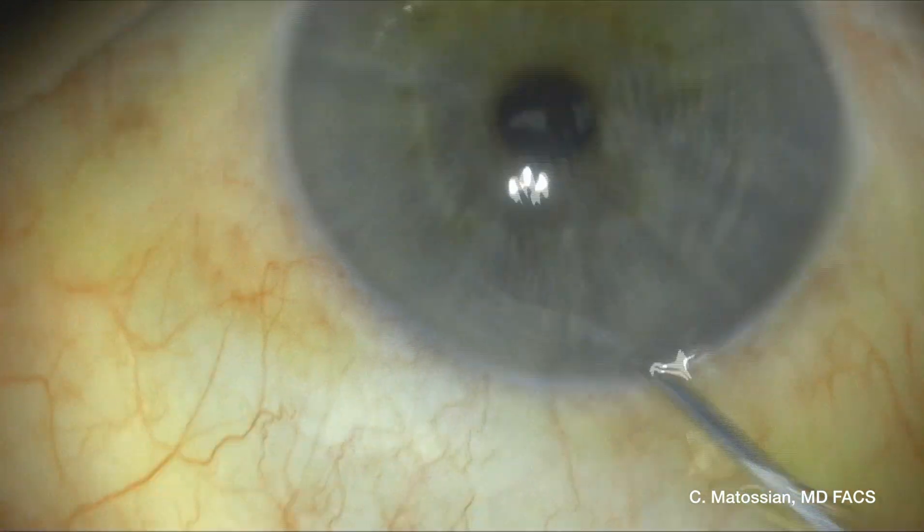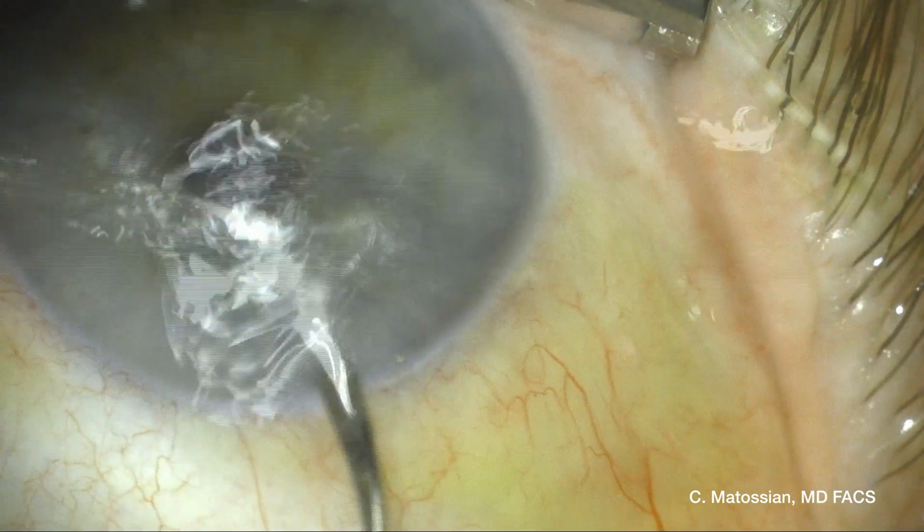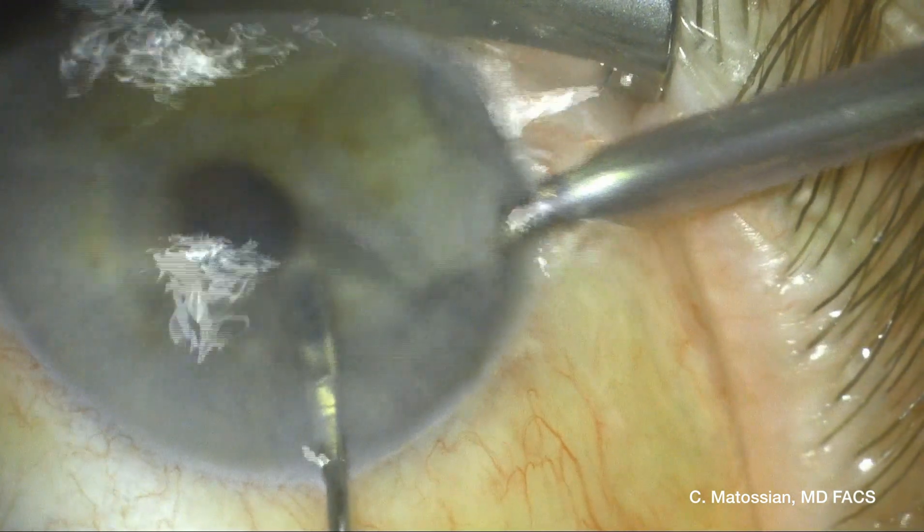As you can see, the pupil is constricted. I placed him on pilocarpine in order to avoid that nuclear fragment from falling through the pupil.